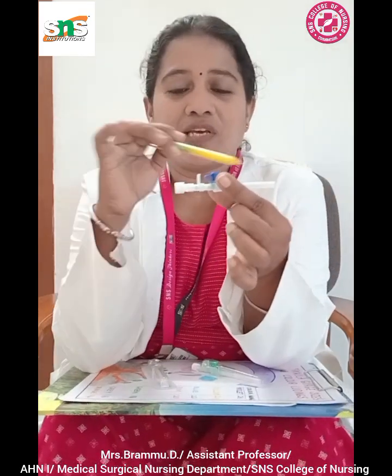When you open the IV cannula, as we all know, we do a hand rub, work in a sterile environment, and wear gloves. But as I told you earlier, we are not going to deal with the IV cannulation, I'm just explaining the parts of the IV cannula, so please excuse me for using bare hands, not gloves, and I would like to use my pen as a pointer. So, dealing with the parts of the IV cannula.